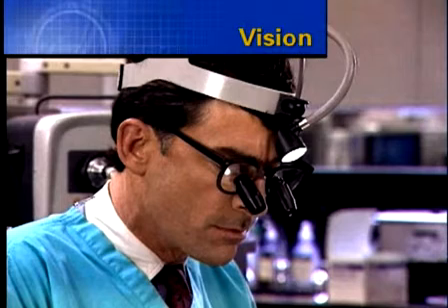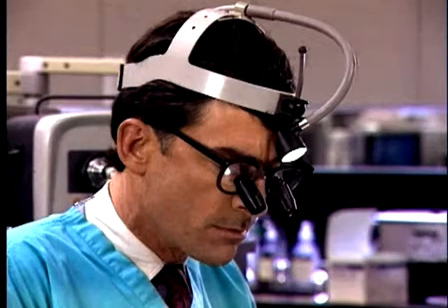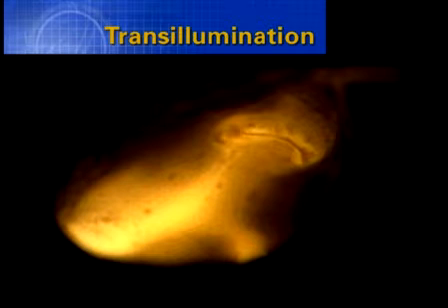Another important idea for locating canals is having great vision. Here we see a headlamp and magnification glasses. Transillumination is another idea, and the dental assistant can hold a fiber optic wand either above or below the rubber dam playing light buccal to lingual, and at high magnification, with the microscope turned down, notice the groove off the MB1.